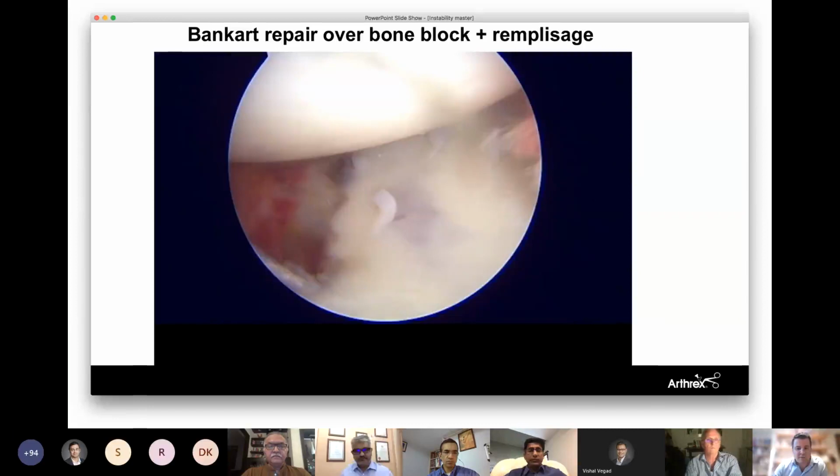You're obviously very skilled. I was never tempted by the arthroscopic Latarjet. We used to only do open Latarjet and just about 95% of my patients, who were rugby players, got a Latarjet. I always used to use the low-profile wedge plate because, as you said, it does give you that little bit of confidence when you're tightening the screws, and better compression, less likelihood of fracturing the bone block. But my patients were slightly different.